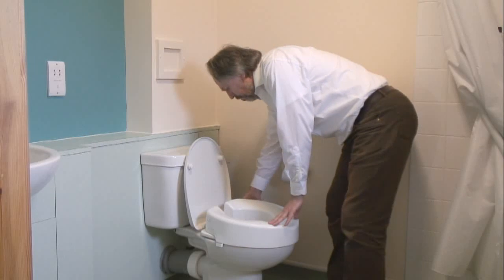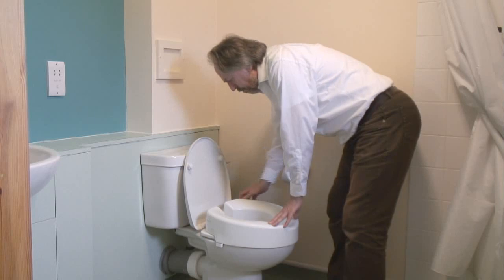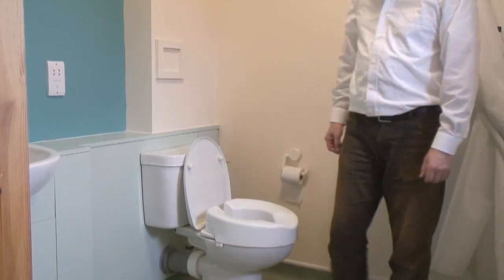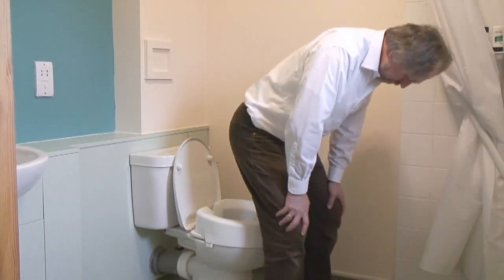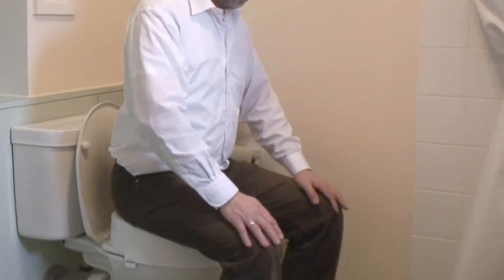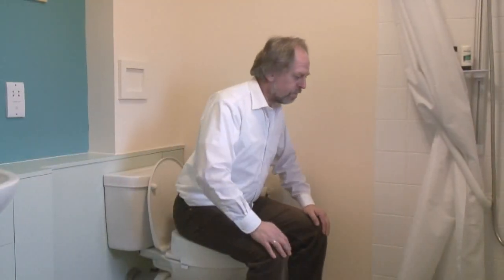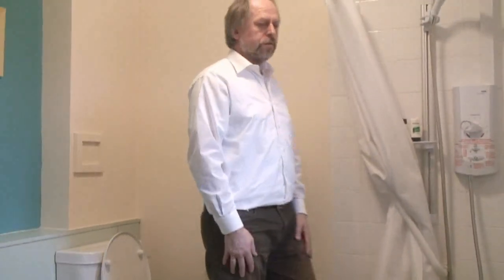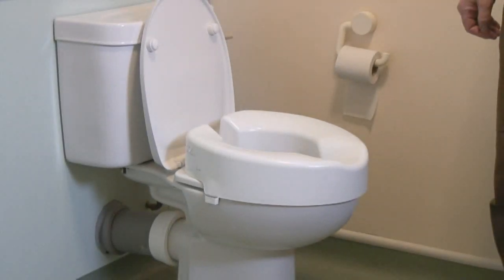If you want to just pop that in place — as I say, each one will fit slightly differently. It will have certain adjustments to fit securely to your existing toilet. Just trying to lower yourself onto that without holding on to anything. You've got far less distance now to go down. Feet still securely on the ground, hips are now slightly higher than your knees. To come up from there — much easier now, isn't it? Something simple like a raised toilet seat can just give you back that bit of independence.